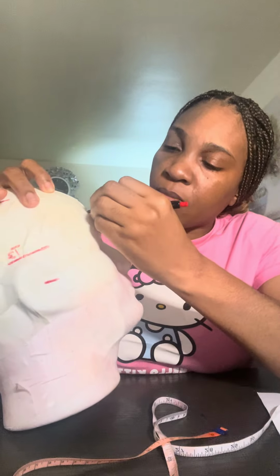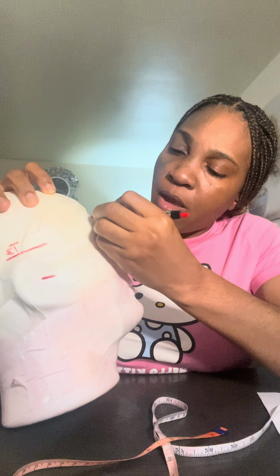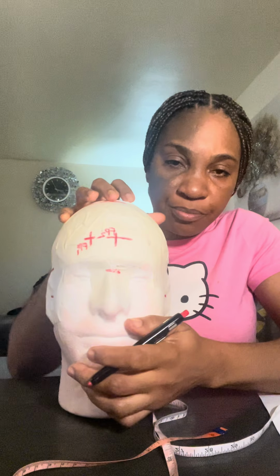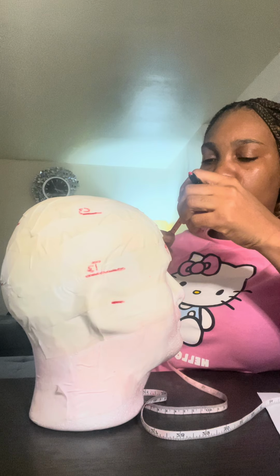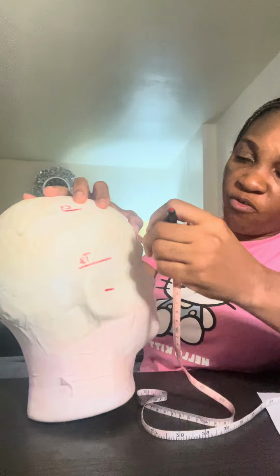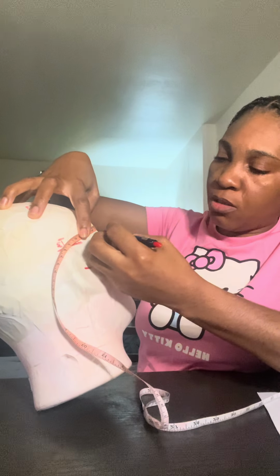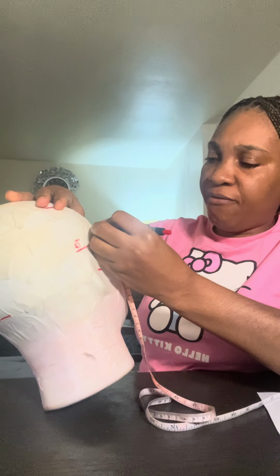Okay, which is going to give me my true FP1. Okay, my true FP1. Now the next step is to put my tape on the 0 mark on FP1, going to T3, 20%, which is 5.4. This is going to be my F7.